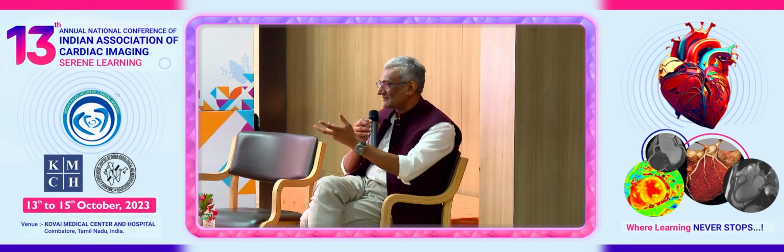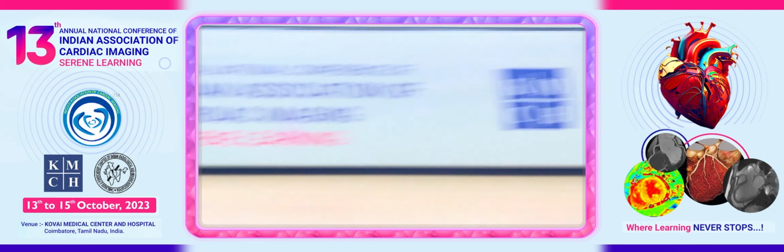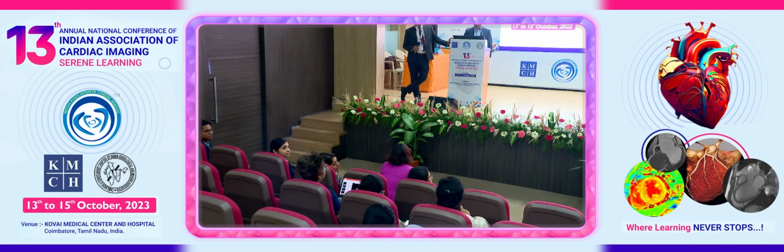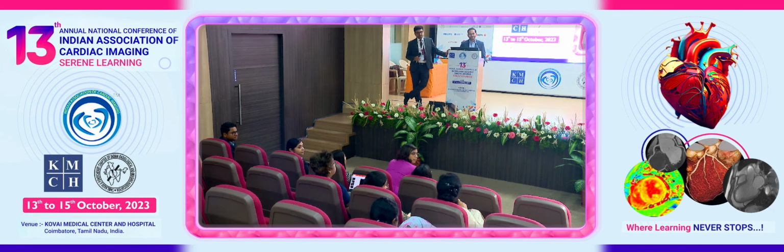Priya, go ahead. I just wanted to say the same thing, that gating actually shouldn't matter, because we are doing calcium scoring on the non-gated ordinary NCCT chest also. What we found was that yes, we did miss some calcium, but the difference was just 5 to 10%, and it does not make a difference whether the score is 250 or 300. What is important is whether it is 0 or non-zero. Unless you want to see the underlying vessel and you are going to do a coronary CT angio and don't know whether you will be able to see the vessel underneath. In that case, gating would probably help, but otherwise there is no need.